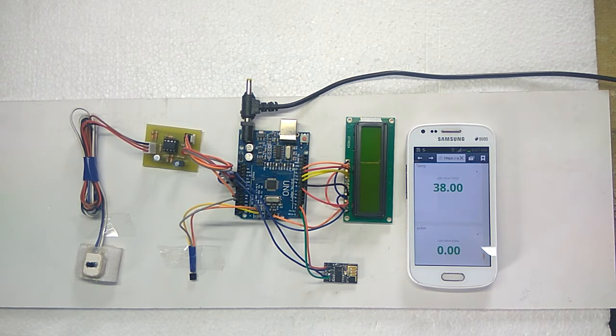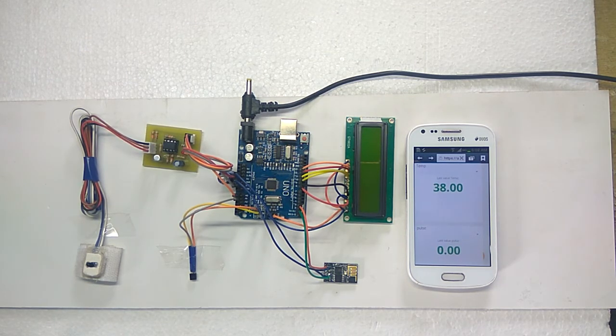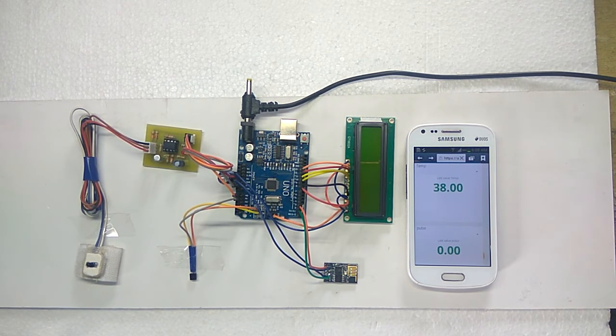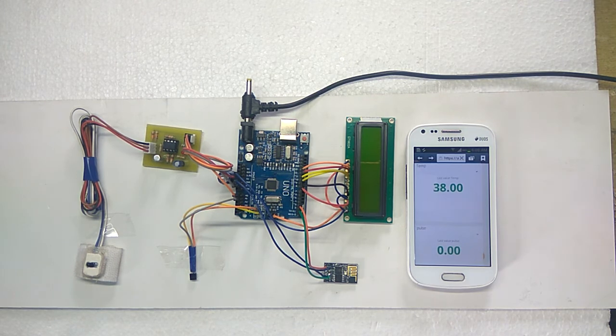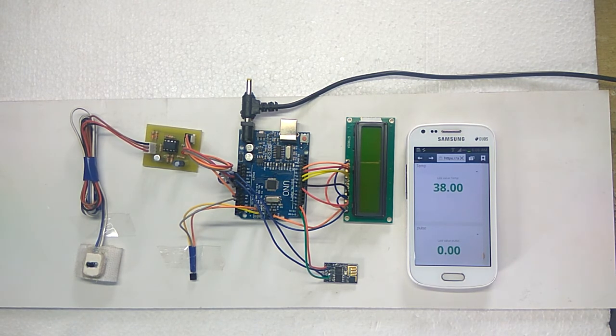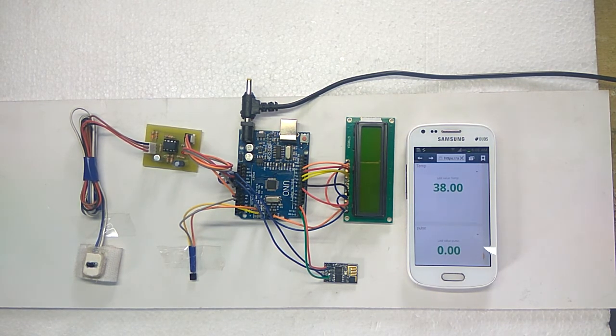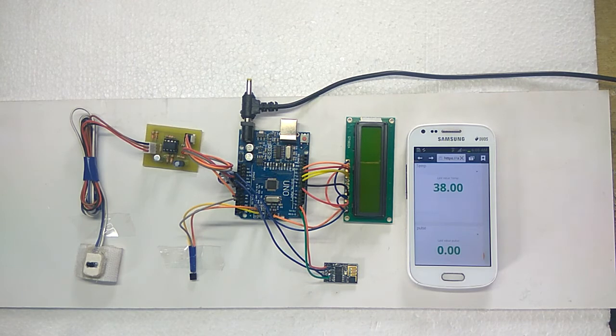Arduino measures the heart rate and body temperature continuously and sends this data to UBIDOTS. Also, it will be displayed on the LCD.